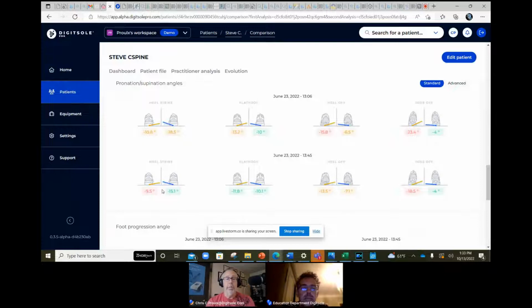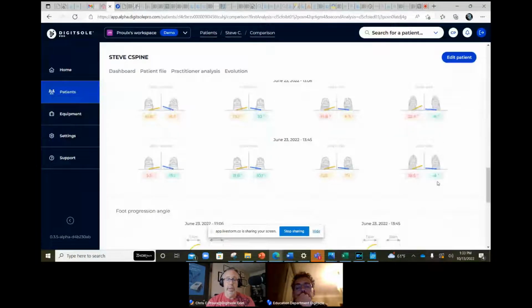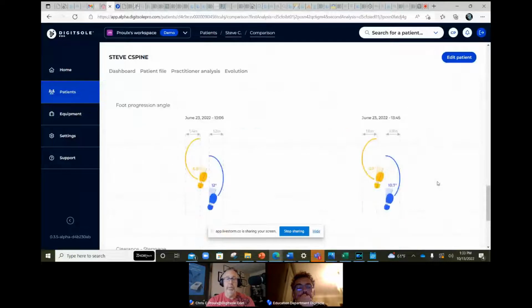Okay, we reduced it from the beginning, and we were normalized between the foot flat position. So that's actually a good start, because remember that foot flat position is also going to be his sort of safety position. But if we go all the way into the toe off position, we see that we went from -23 to -18. So we're still not at 4. We're still not as good as the right foot, but we saw about a 20% difference, again, just within that. And I'll explain why that was pleasing to us.